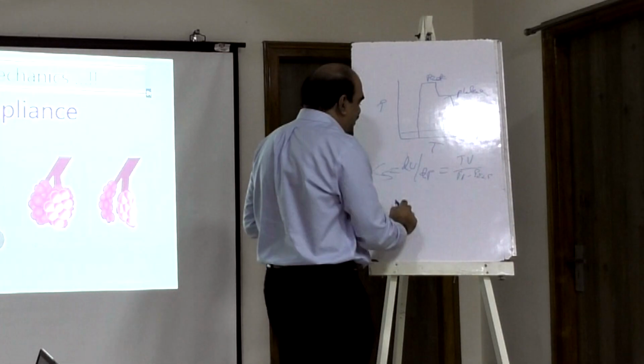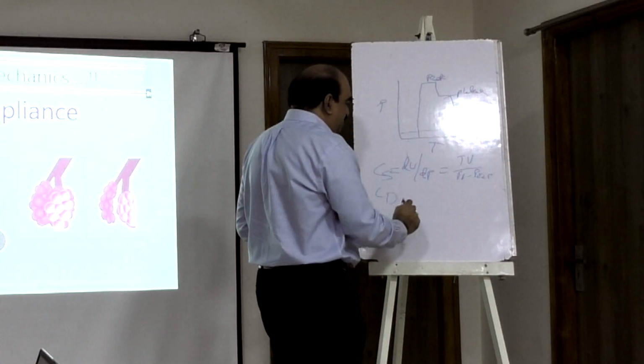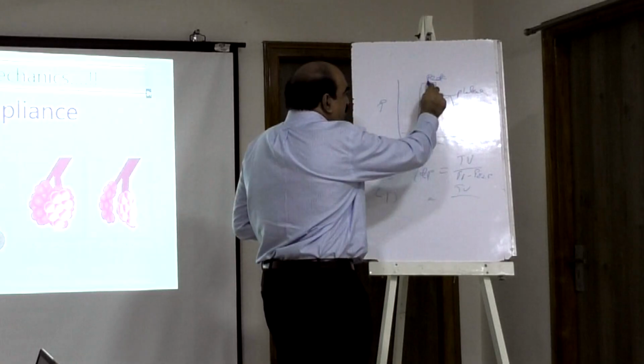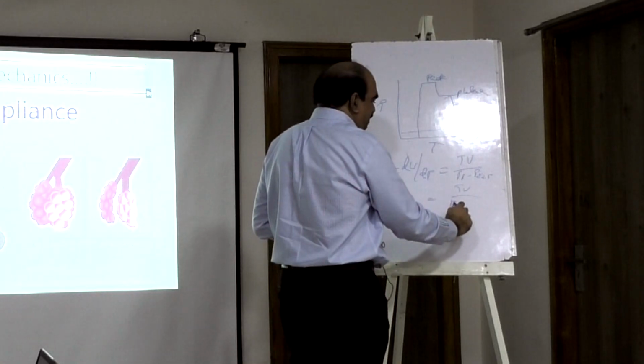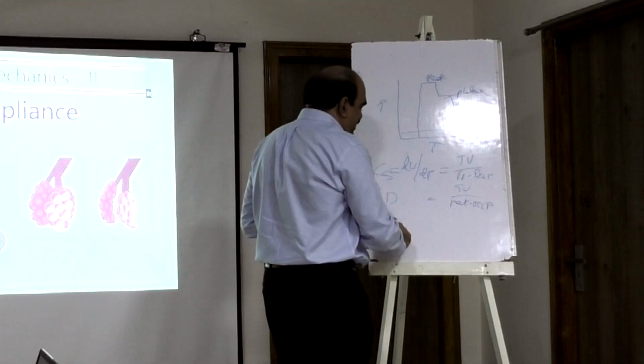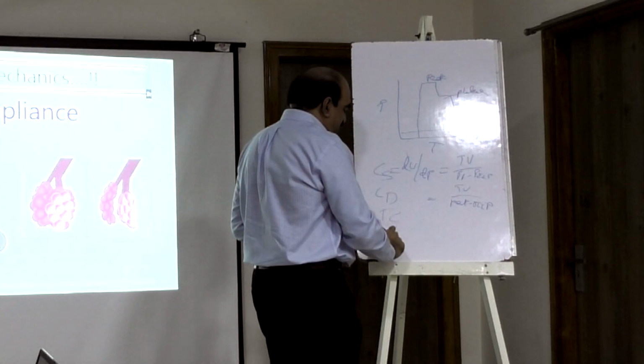So we can get static compliance. With dynamic compliance, tidal volume by PIP minus PEEP. Then total compliance. What is driving pressure?